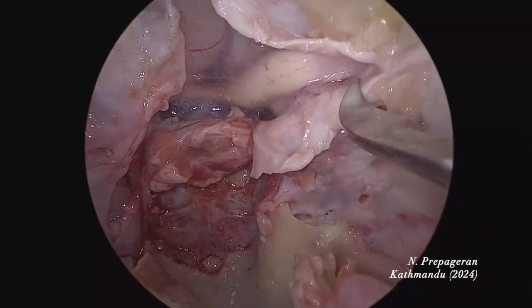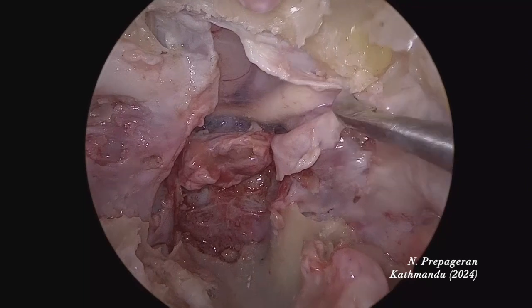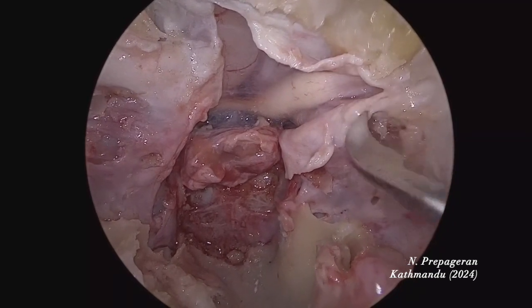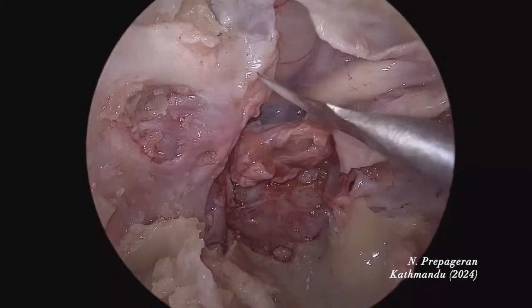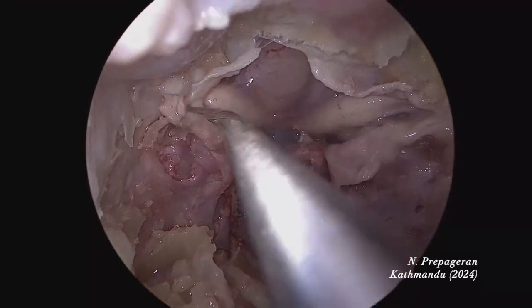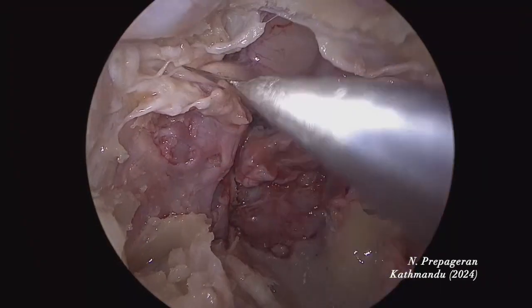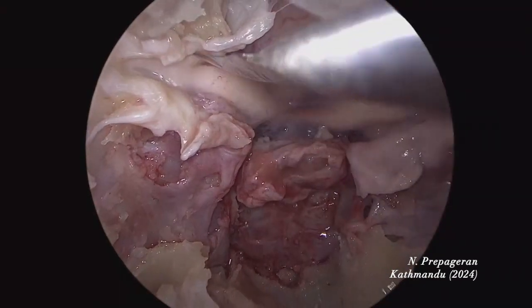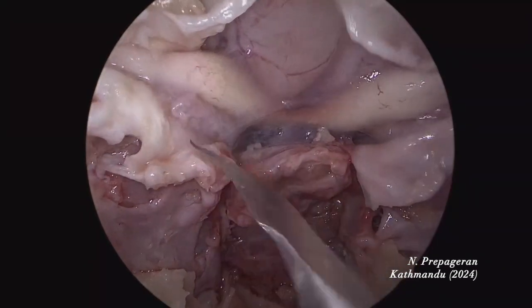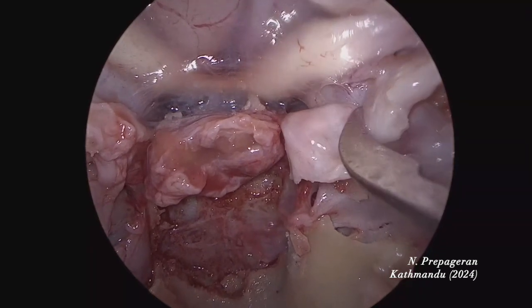That's the ophthalmic artery down here. This is exactly like what we cut yesterday. See how much perineural sheath you have along the optic nerve — it's very difficult to injure the optic nerve. You have to injure all of this to injure it. Now I'm going to cut across this one and cut the entire perineural sheath. That's the optic nerve coming into view. On the right side we have not touched the ethmoids — turbinates are all intact — but you have enough exposure to do all this skull base surgery.